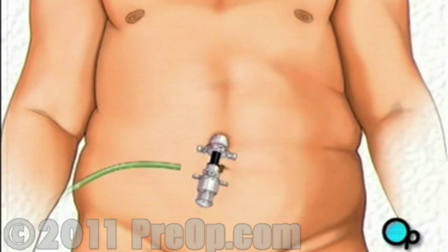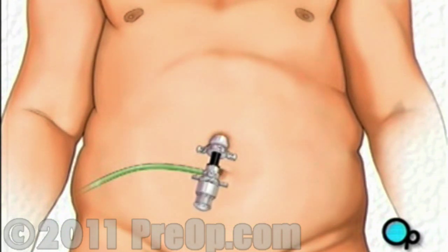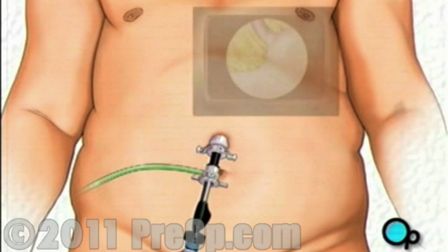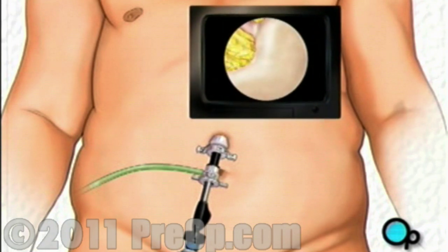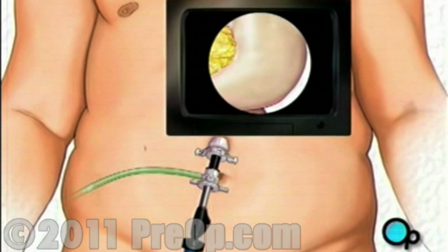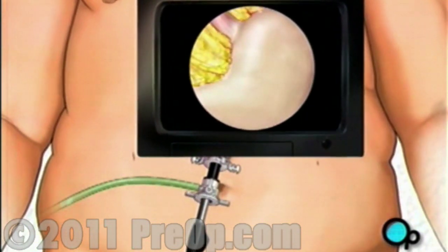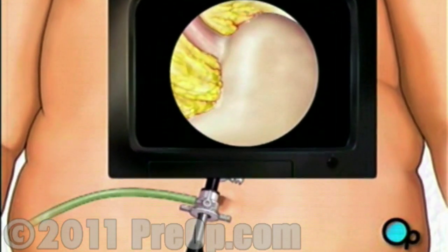Harmless carbon dioxide gas will be used to inflate the abdomen, serving to enlarge the work area and to separate the organs. The team then inserts the laparoscope. Once in place, the laparoscope will provide video images that allow the surgeon to see the inside of your abdomen. Next, the team makes four more incisions, taking special care to keep the openings as small as possible. These openings will provide access for other surgical instruments.